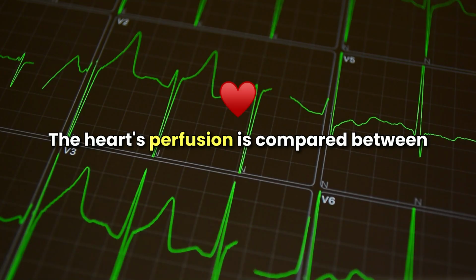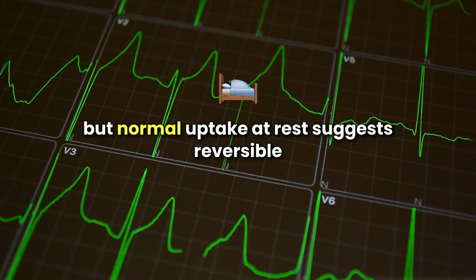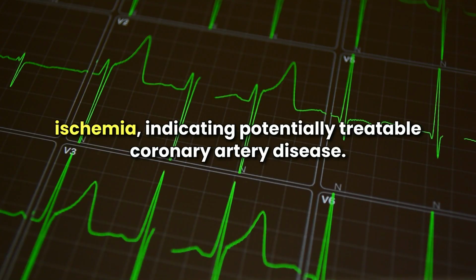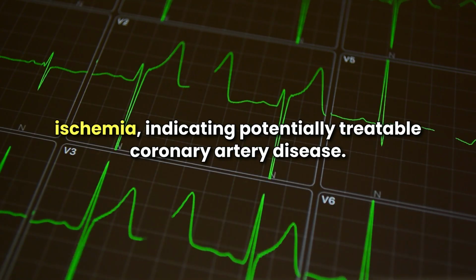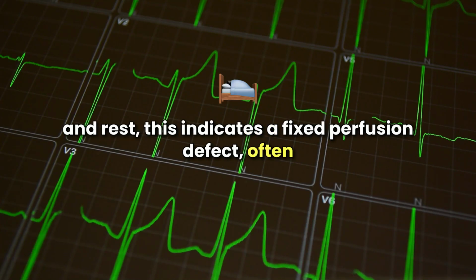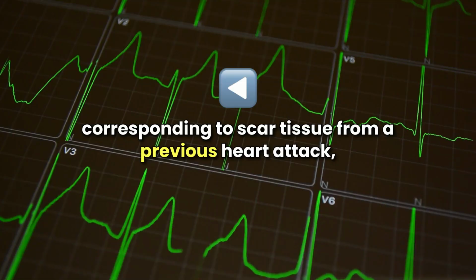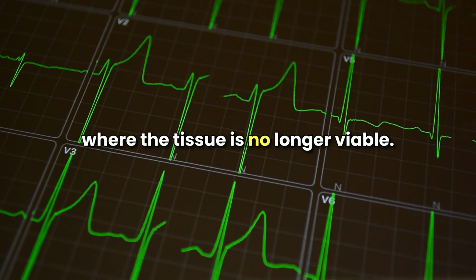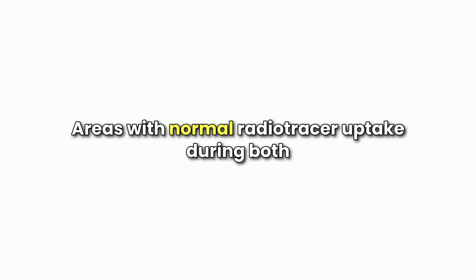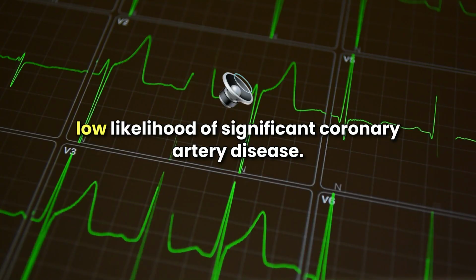The heart's perfusion is compared between the stress and rest phases. Areas with reduced radiotracer uptake during stress, but normal uptake at rest suggest reversible ischemia, indicating potentially treatable coronary artery disease. If an area shows reduced uptake during both stress and rest, this indicates a fixed perfusion defect, often corresponding to scar tissue from a previous heart attack, where the tissue is no longer viable. Areas with normal radiotracer uptake during both phases indicate normal blood flow, suggesting a low likelihood of significant coronary artery disease.